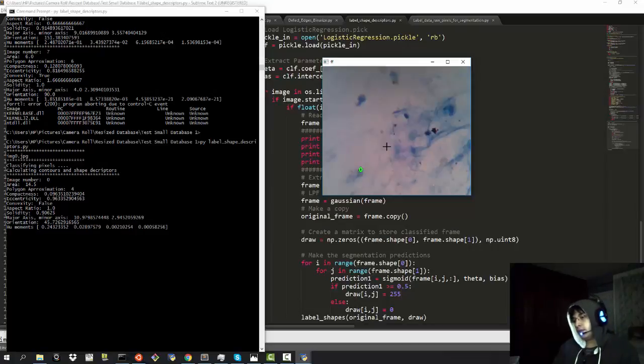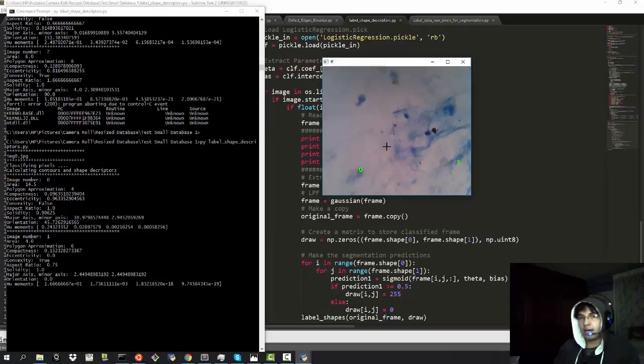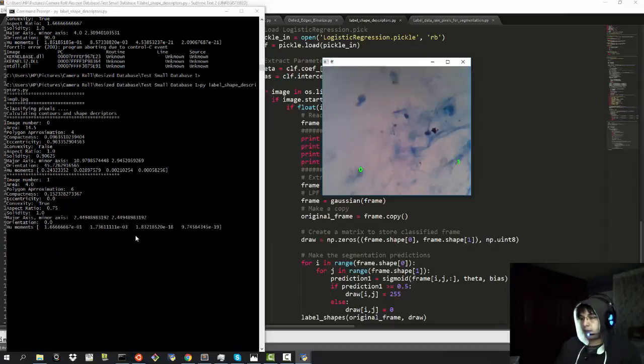So this is not a tuberculosis object, so we press N, and this whole classification goes to a .csv file so that we can make a classifier later more easily. In order to explain a little bit of how these features work, here we have a very good example.